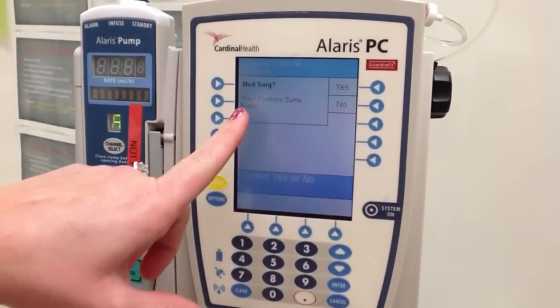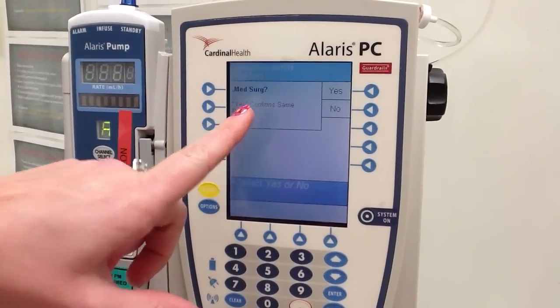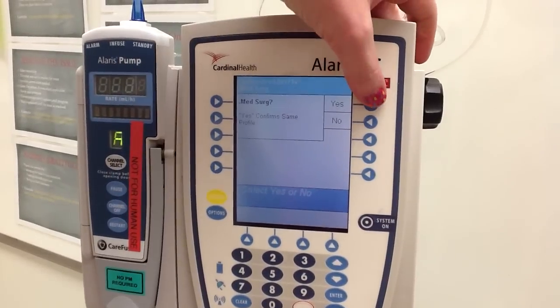It's going to also ask you which floor you are on. For our purposes, we are going to say med-surg.